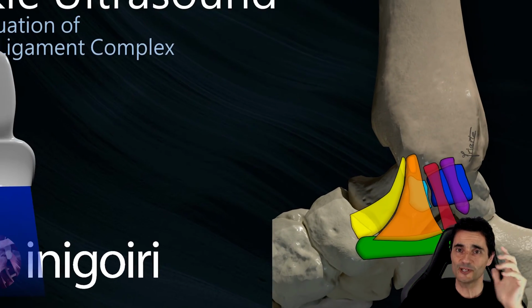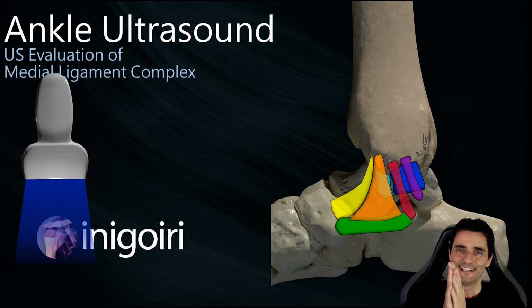Okay, that was all. No more and no less. That was all the components of the medial ligamentary complex of the ankle.